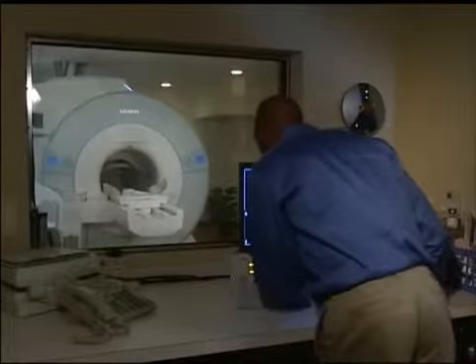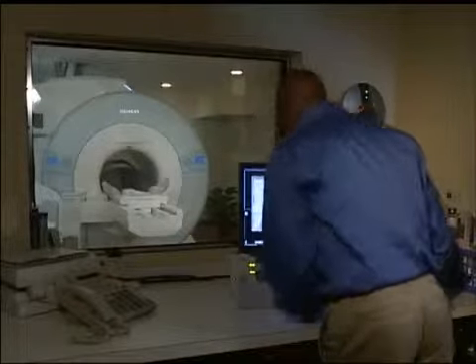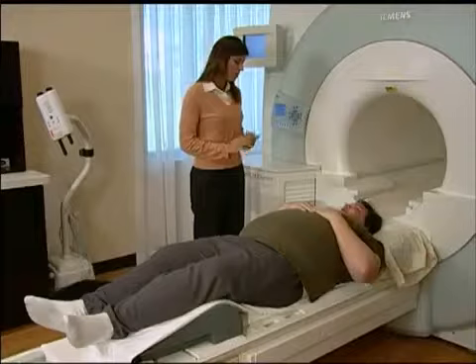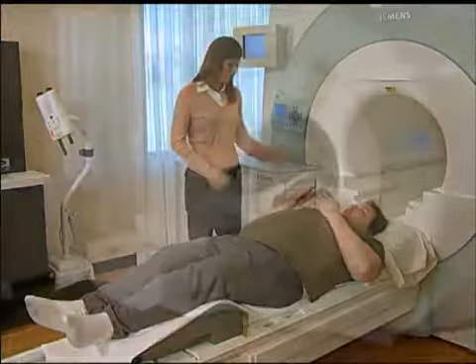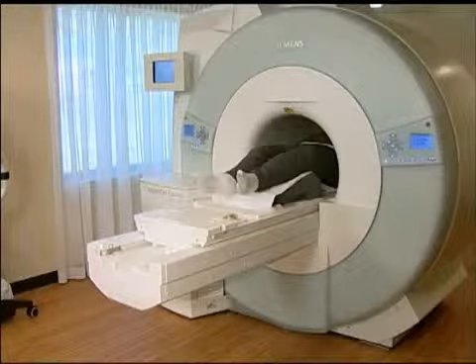How are you doing in there? I'm doing good. It is very important that you remain still while the images are being acquired. You'll know that an image is being acquired when you hear a knocking sound.